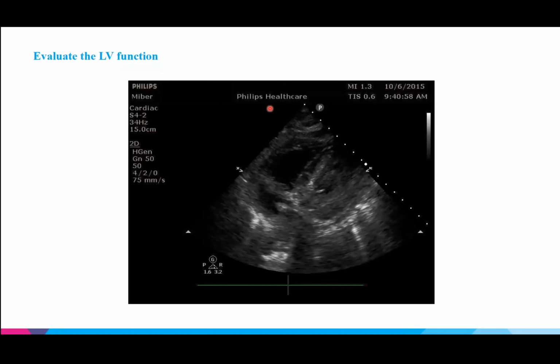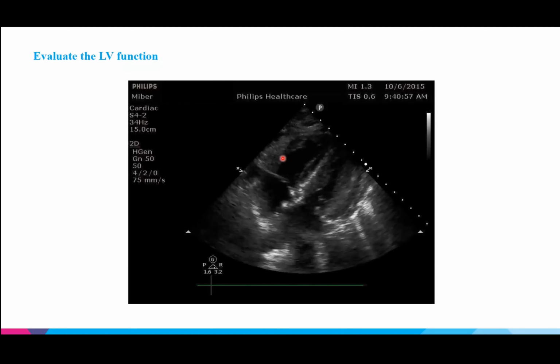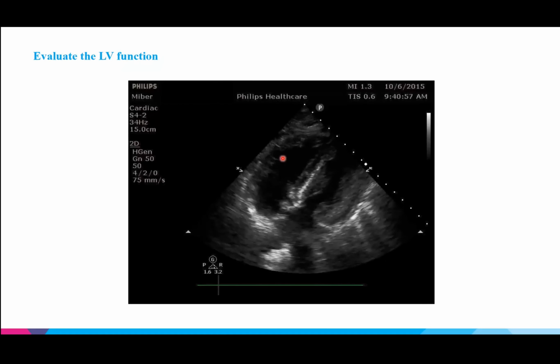All right, so we have 79% with hyperdynamic, and then around 21% saying normal. Nothing for reduced or severely reduced. So, okay, a couple of things. Okay, good. All right, Juan's already ready.